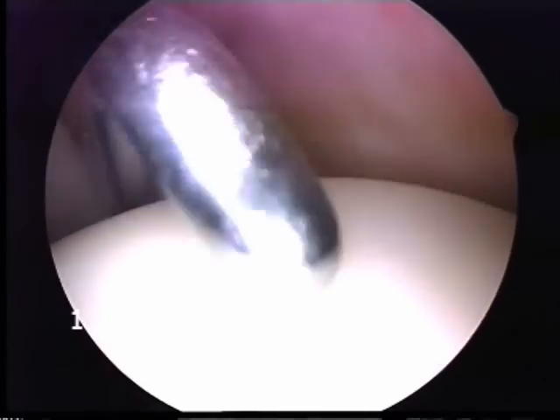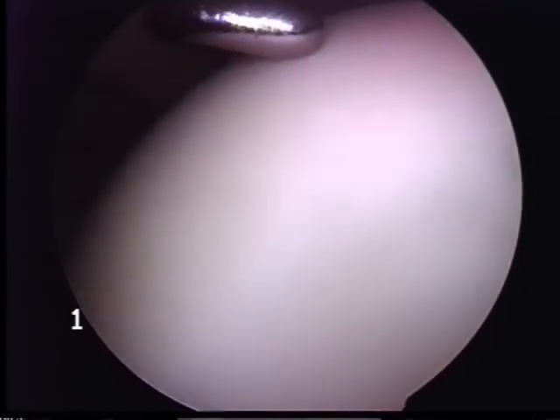Again, the undersurface of the supraspinatus tendon is visualised above the humeral head.